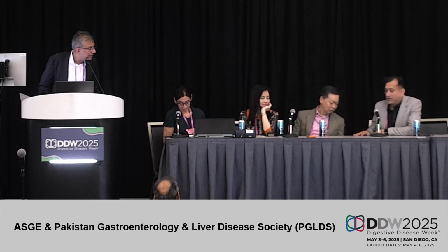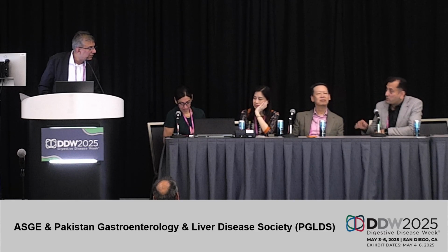Just a small question about the role of antibiotics. Mediastinum is a closed space and the guidelines don't recommend them. But do you think that, as mediastinum is a closed space, there is a role for some prophylactic antibiotics? Or have you encountered any infection during biopsy? Hardly. I don't know. I mean, it has not happened.